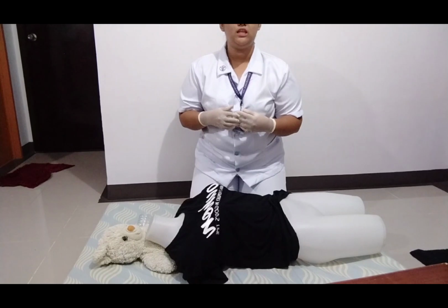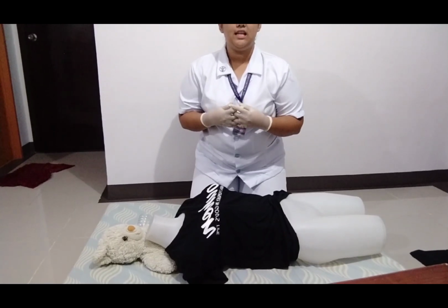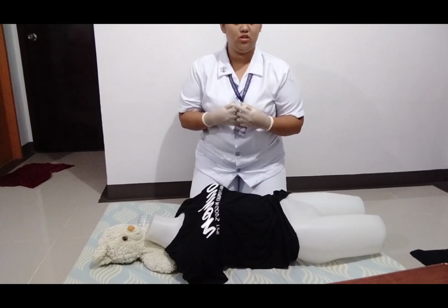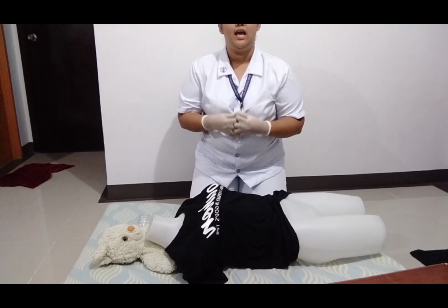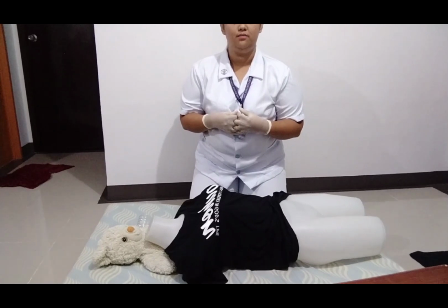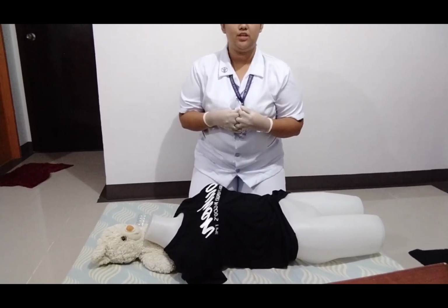I am going to proceed now in performing the cardiopulmonary resuscitation or the CPR. CPR is a life-saving skill that combines chest compression with artificial ventilation to maintain lung function until further measures are done to restore spontaneous blood circulation and breathing of the patient who has gone into cardiac arrest. So now we are going to deliver high-quality chest compressions.